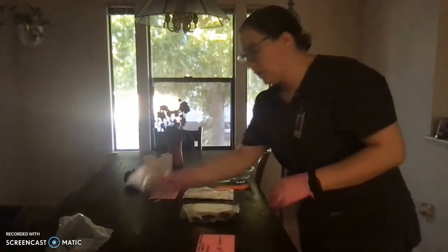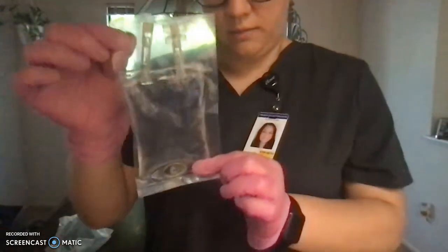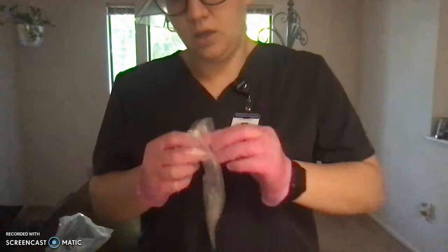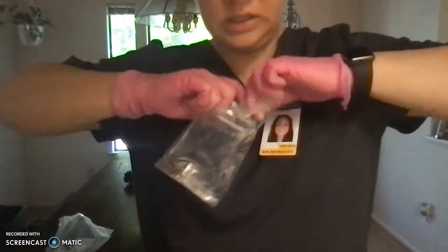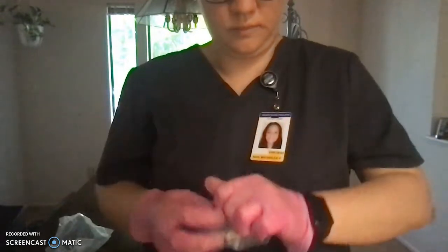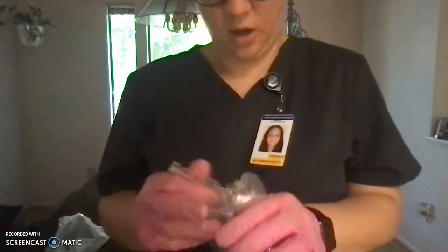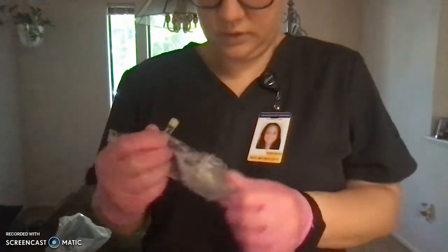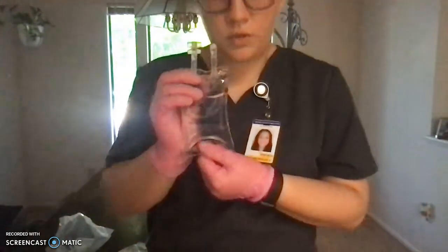Once again, you want to inspect and make sure that it is sealed and that your sterile end is correct. You're also performing your 6 rights again, making sure that there's no allergies. I also forgot to mention that I clamped off my primary tubing before I left, unless the orders say otherwise.